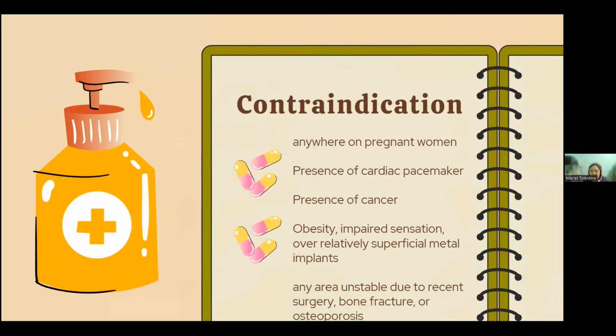It is contraindicated anywhere on pregnant women, presence of cardiac pacemaker, presence of cancer due to risk for metastasis, obesity, impaired sensation, over relatively superficial metal implants, and any area unstable due to recent surgery, bone fracture, or osteoporosis.